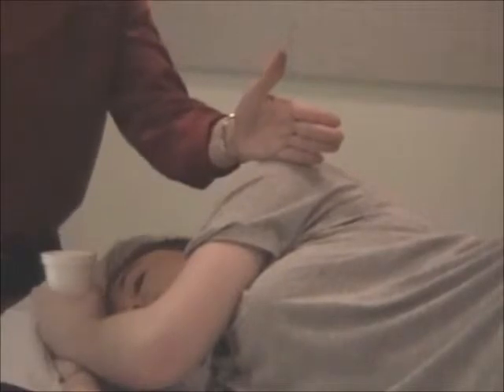And I can also look at the patient's neck, that trick that I talked to you about before, and make that crosshair come right down there. Okay? And the instructions to the patient would be the same.